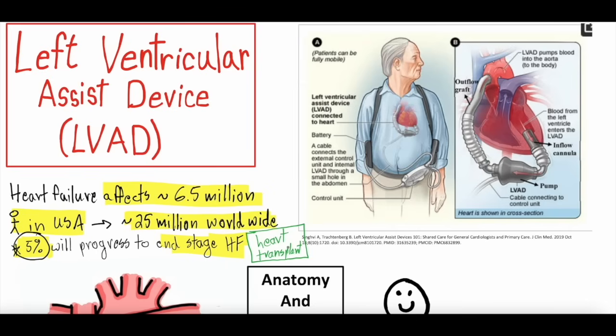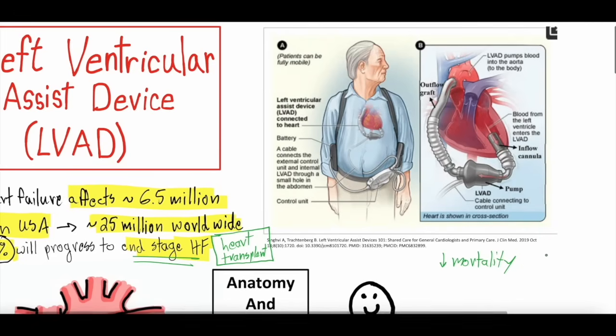So there's lots of patients with end-stage heart failure who either are waiting for a transplant, don't qualify for a transplant, or don't want a transplant, who may benefit from a left ventricular assist device. In fact, when they look at the numbers, what they have found is that there's been a huge decrease in mortality, all right, and that's death. When they first started studying LVADs, the survival for those on medical management was about 5 to 10% at 2 years for end-stage heart failure.